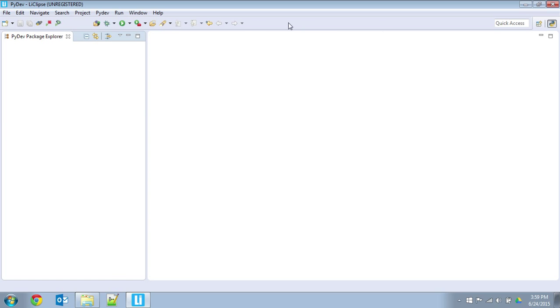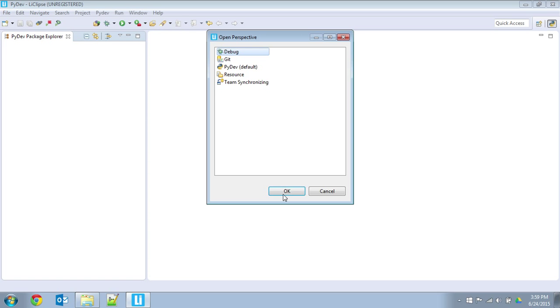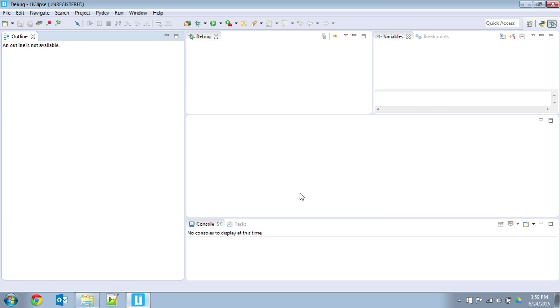They might be in a different location. They might be over here. They might be on a second row. But basically, you're looking for these two icons. Then we're going to go to Window, Perspective, Open Perspective, Other. And this will take you to the debug layout, which is great.